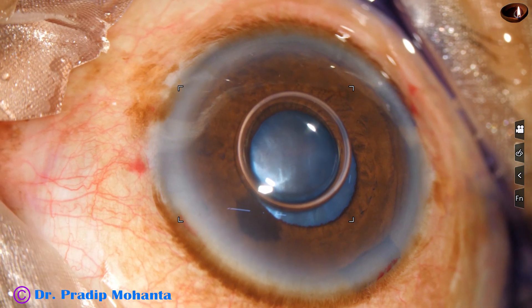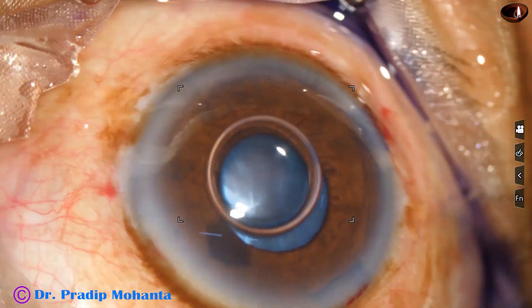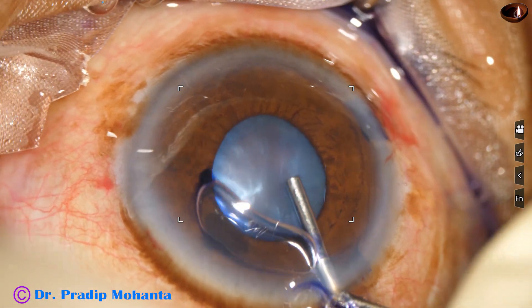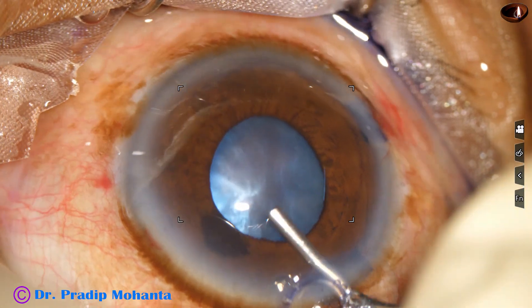The size of the pupil is about three millimeters, and it is not enough to manage this hard cataract and intumescence.